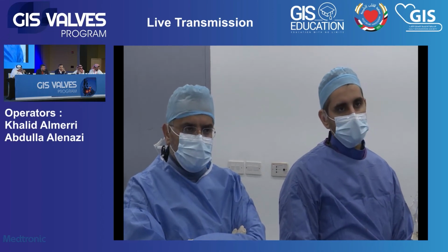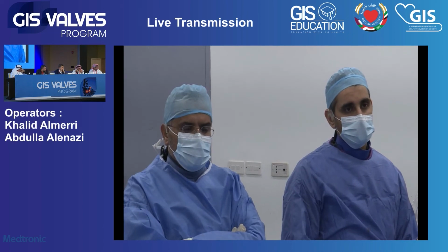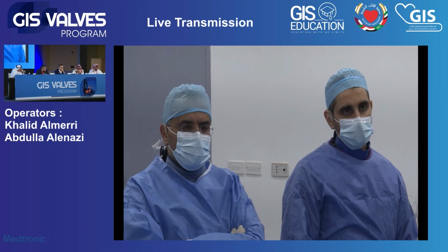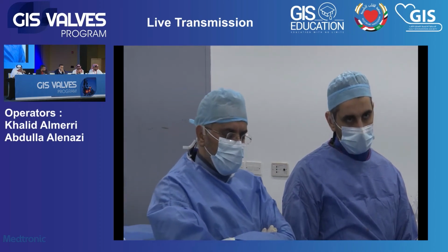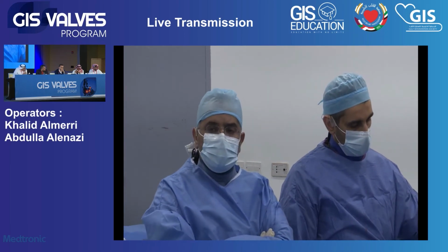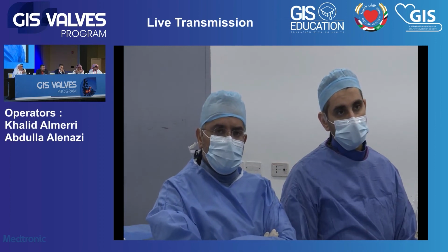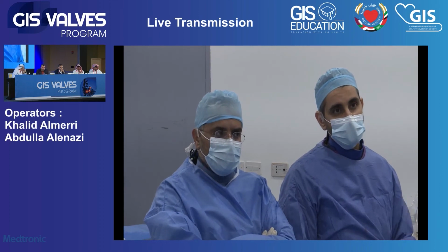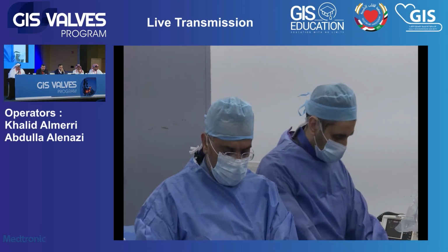Any comment from the panel, Muhammad? I think I will agree, especially with the self-expandable valve. Sometimes you see some conduction delay, so it is reasonable to keep it, but not in every case. Even with the self-expandable valve, sometimes, with high implantation, we're having good results, and you remove the pacemaker in the cath lab. Any comment? I think this case is an example of this. I think we removed the temporary pacer. Certainly, that was a good case.